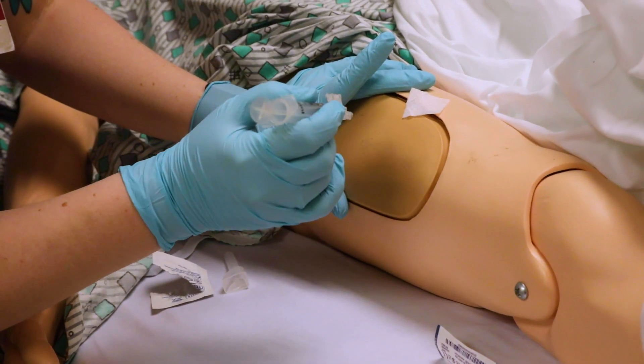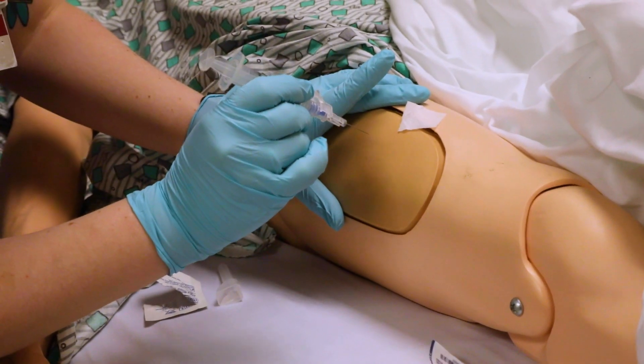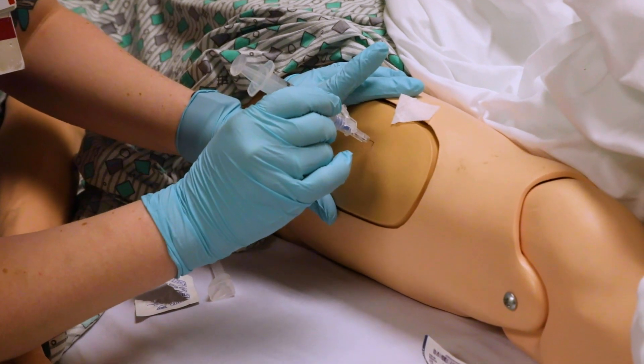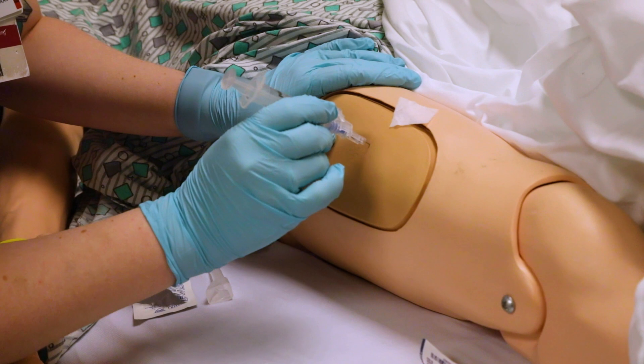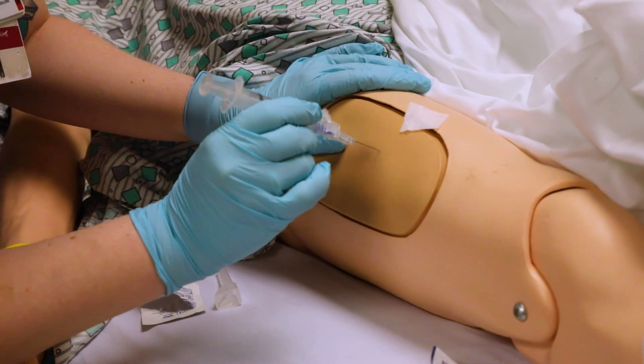We're going to do a one, two, three poke — then you can inject. I'm going to pull the needle back out now — don't actually do this with your patient; I'm just demonstrating before showing the Z-Track technique.